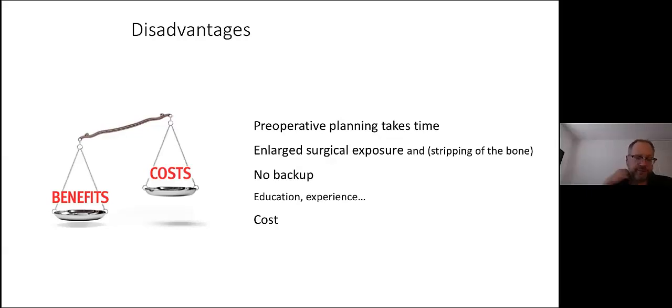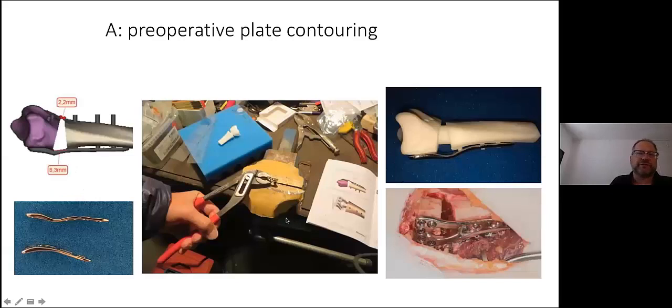So they can, because for some fractures you have 3, 4, 5 days. Some fractures can wait a week. Maybe it's good, so the bleeding will stop, but you have to be quite fast. In fact, it will be very good for fractures. You can see all the different fragments and where the screws will go, how you will hook them up on the screws and so forth.